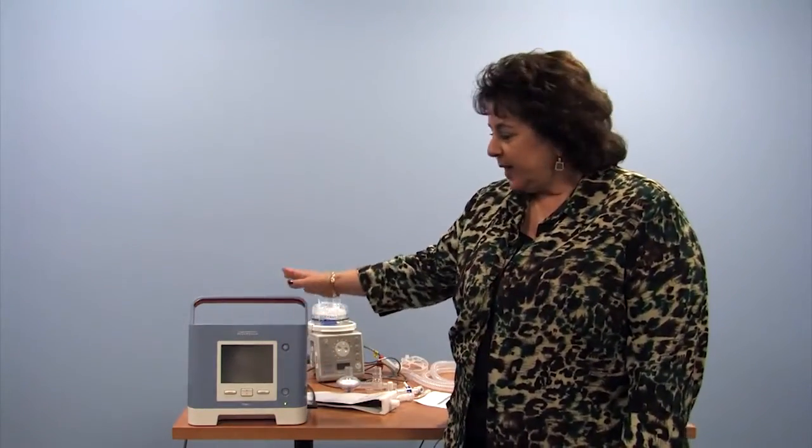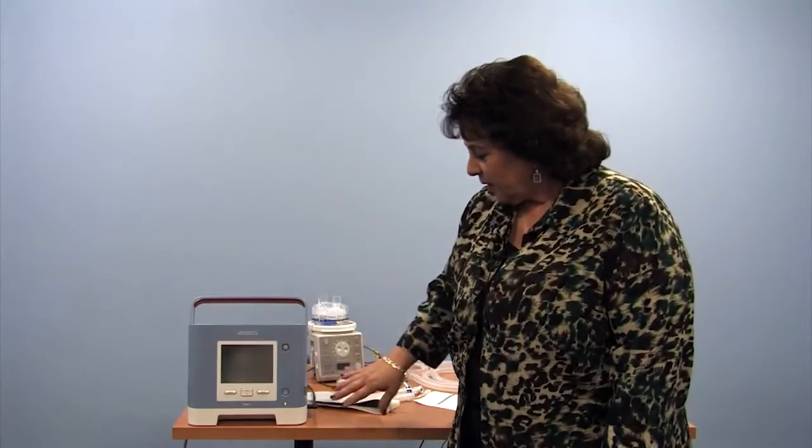There is a stand available, but typically the equipment companies that provide the ventilator for you won't be providing that for you in the home. So it will be sat next to the child on a table. It can be mounted onto or hung from a wheelchair, for example, for mobility.